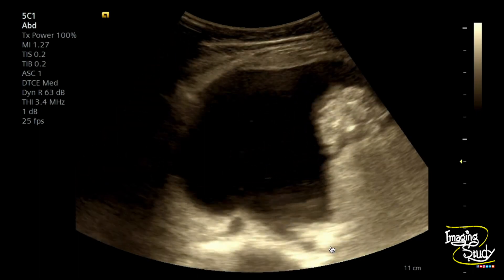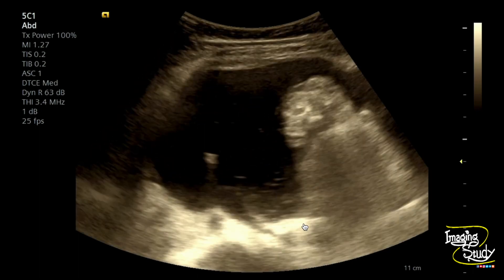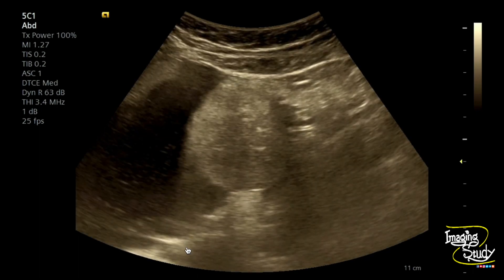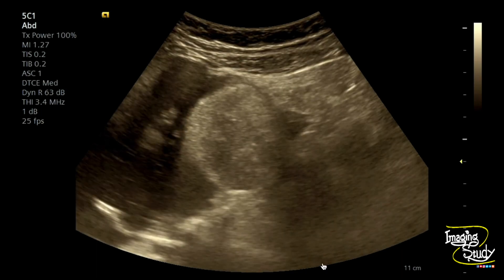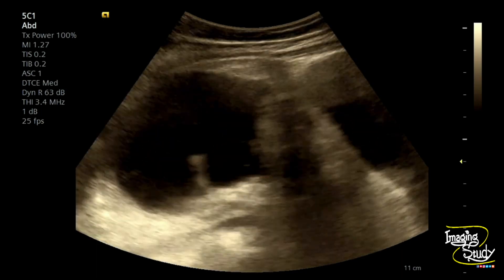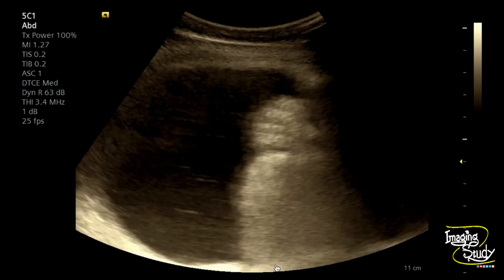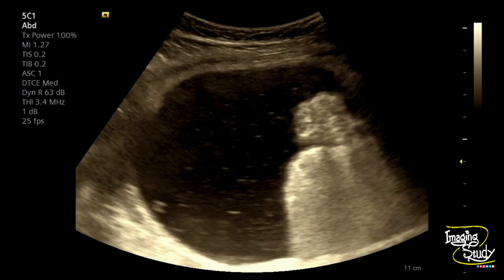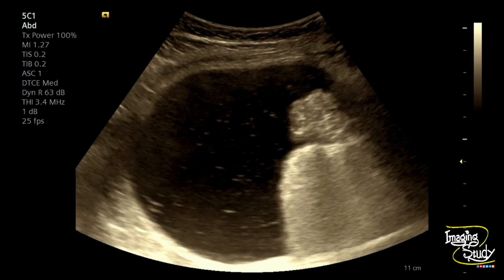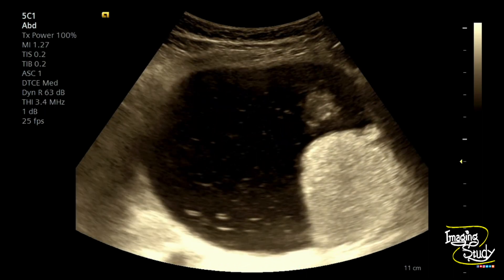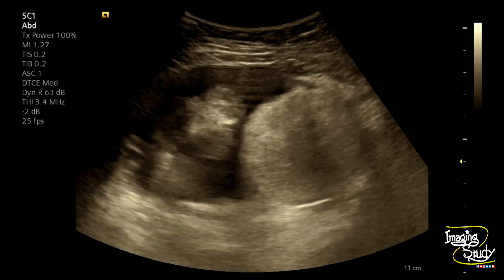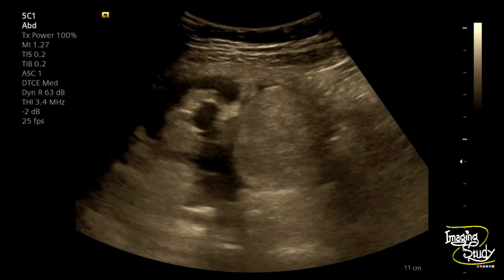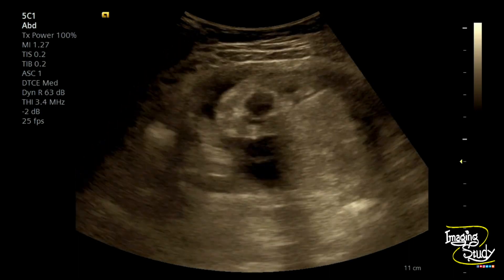If you look carefully, you may sometimes see echogenic components within this cystic area casting posterior acoustic shadows. These are calcified structures — possibly calcified bony components, or commonly dental structures like teeth. Overall, the lesion is unilocular with a smooth inner margin and no definite papillary projection.